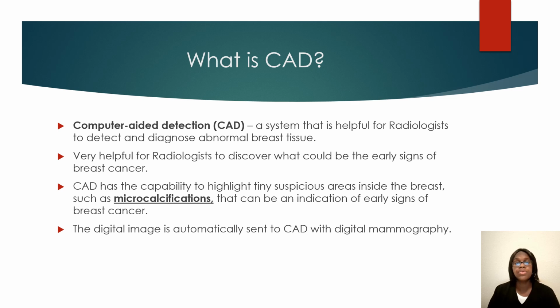If you don't know or remember, CAD is a computer-aided detection system that is going to help the radiologist make a detection or a diagnosis of abnormal breast tissue. The radiologists still read the images, still do their job, but the CAD is just going to serve as a second look, especially for those tiny suspicious areas in the breast, such as microcalcifications, which can be an early sign of breast cancer. That's why the patient will have to come back and get a biopsy if needed.